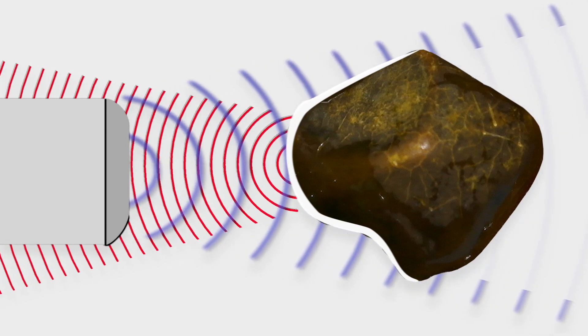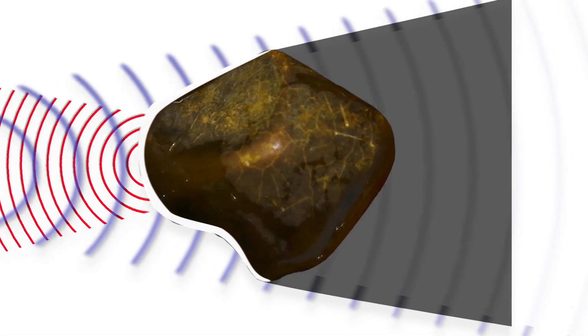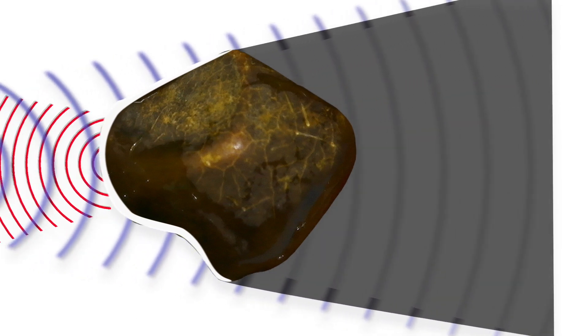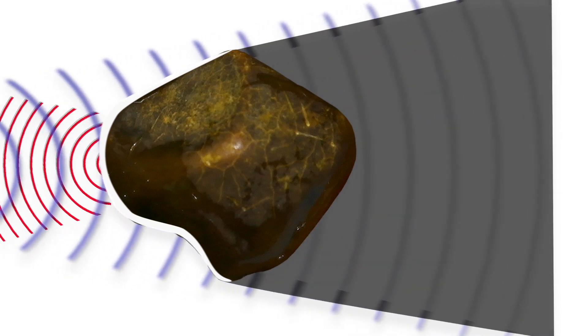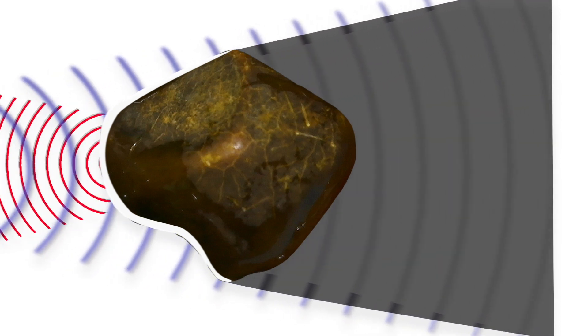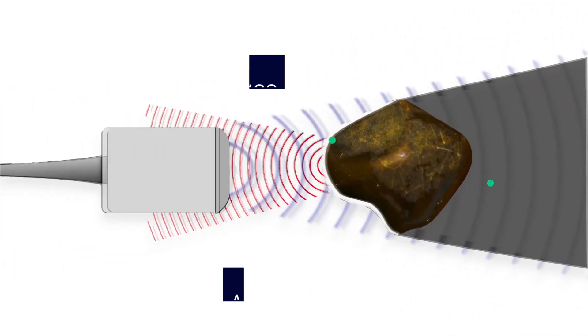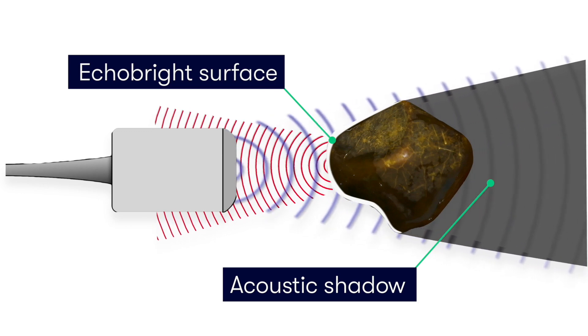The other thing to look for is because all of the waves are reflected back to the transducers and none pass through the stone, this creates a very dark area beyond the gallstone. We call this area the acoustic shadow. So if you look for these two features, an echo bright surface and an acoustic shadow, then you should be able to spot a gallstone.